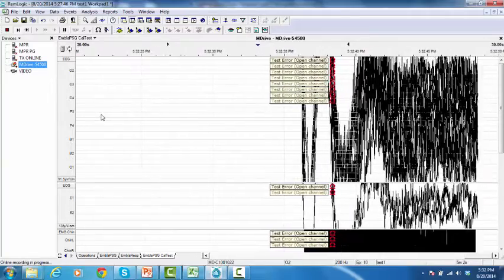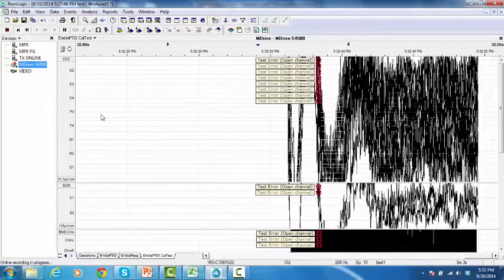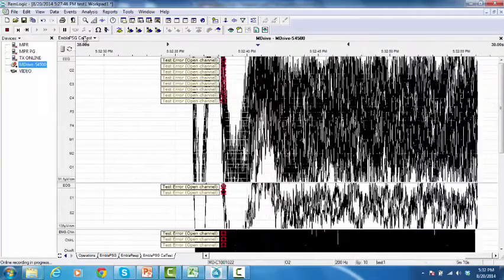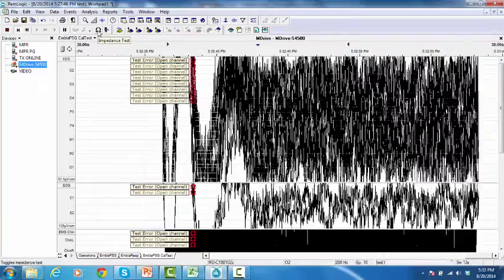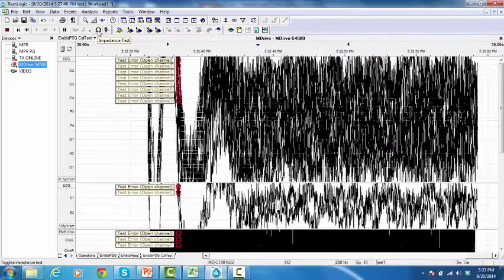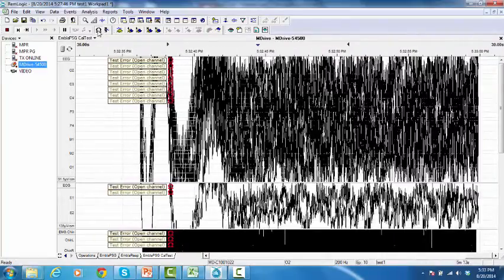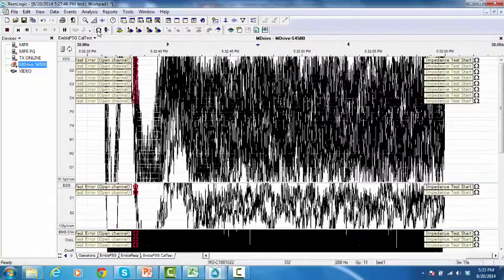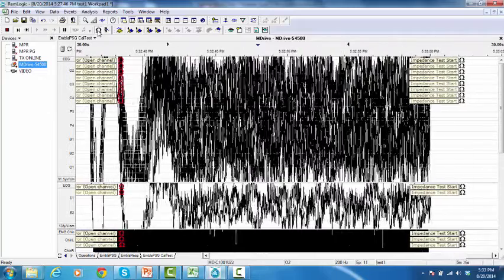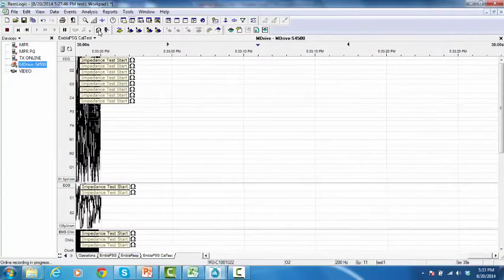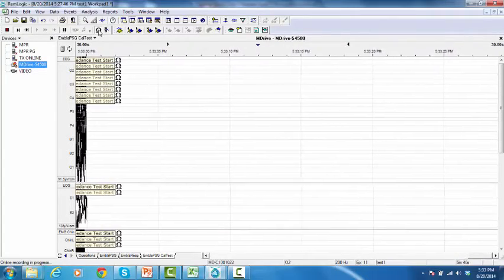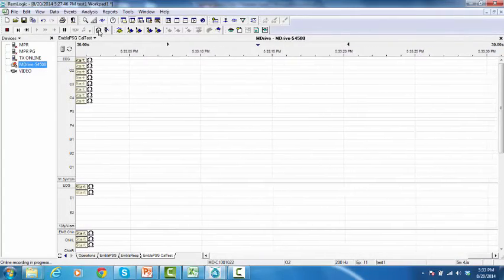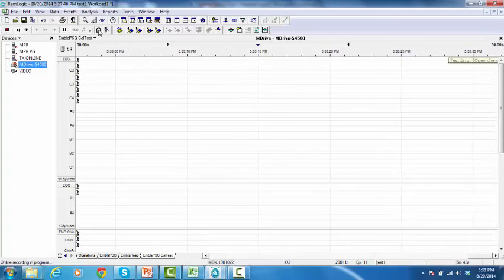The second approach is to click Impedance on the Controls toolbar. And to stop the impedance test, click Impedance on the Controls toolbar.